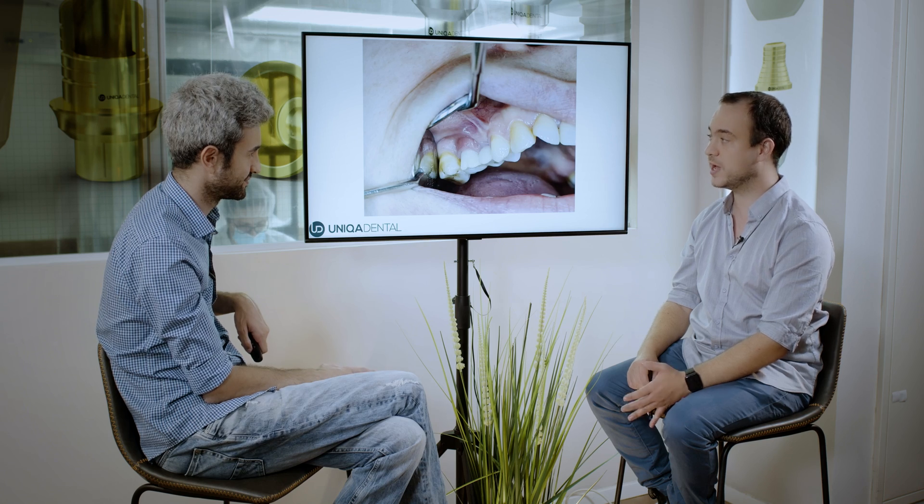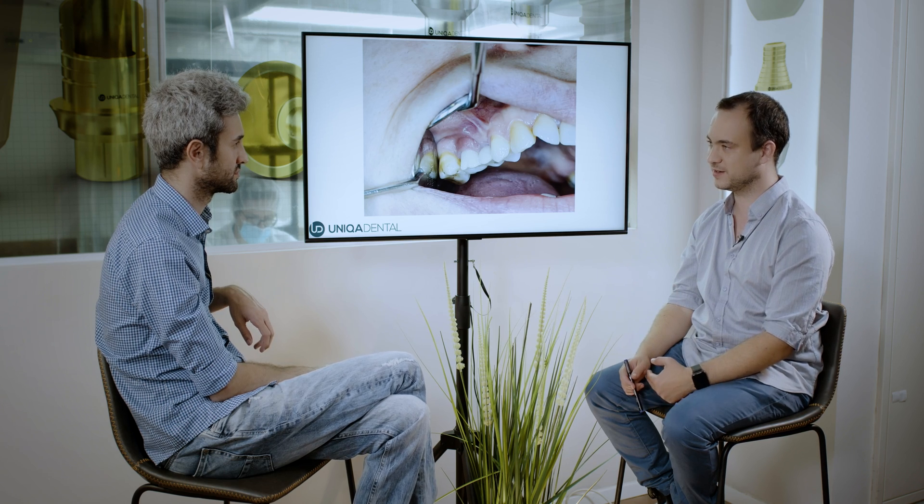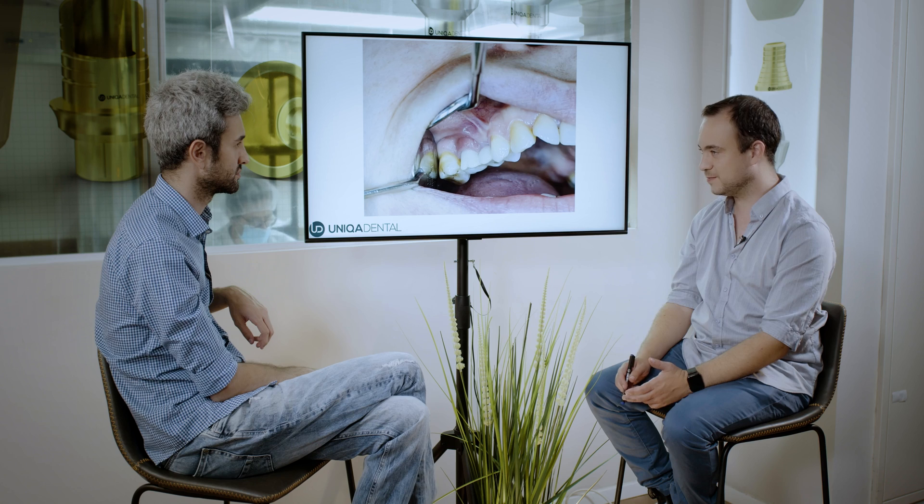This is only in screw retained. In cemented restoration, you have a problem — you're afraid to take off the crowns because if the crown sits very well, you may have to break the bridge to remove them. In extreme cases, without breaking them, you need to make a hole inside the crown, and then it becomes like screw retained. You then need to blindly search for the screw, and you can end up with a huge screw channel by the end of the process.